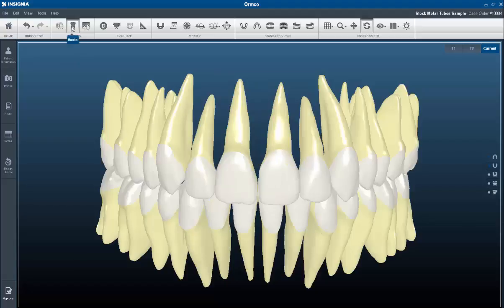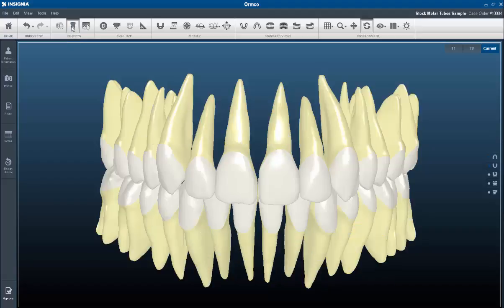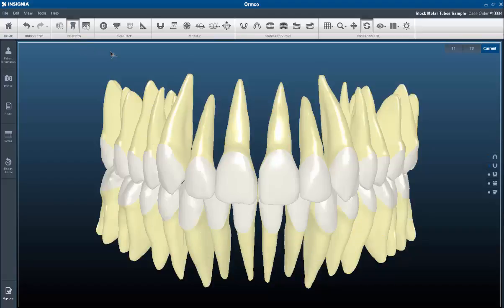The Roots tool is now available. We have integrated CBCT root data, or long roots from our library, which can be turned on or off.